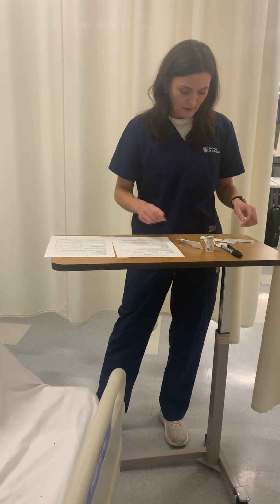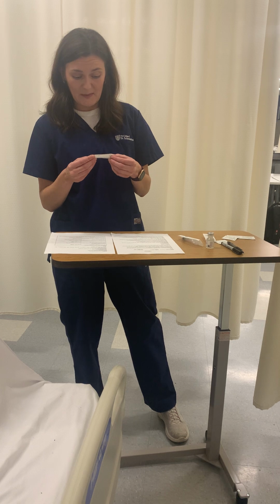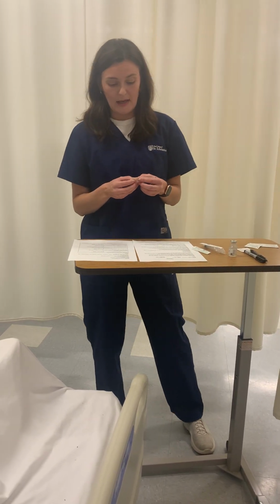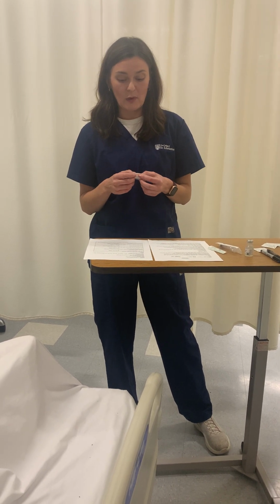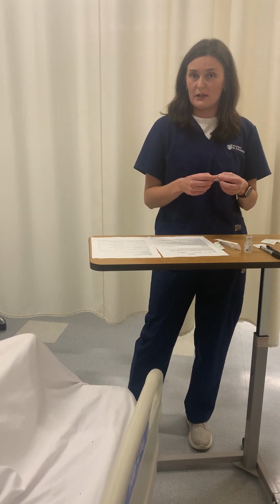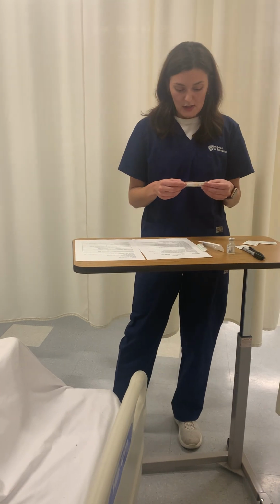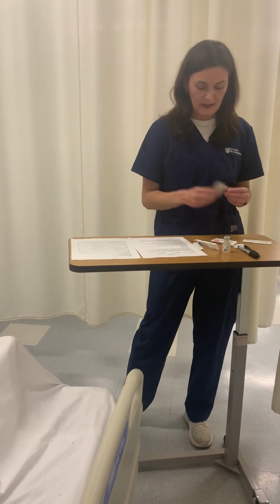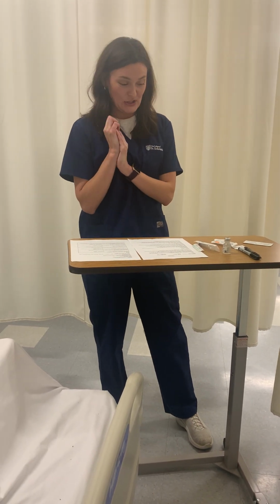Okay. We're going to use our blunt tip needle to draw up the medication. That's intact. And I'm also going to use a 25 gauge. I could do a 22 to 25 gauge for IM, and I'm using a 1 inch because on the chart for her weight, which is 145, we would use a 1 inch needle length for this person's body size. So that is intact, looks good. And I've got my cleaning supplies here. I'm not going to wear gloves for drawing up medicine because I do not need to.